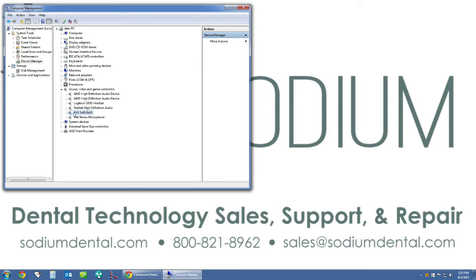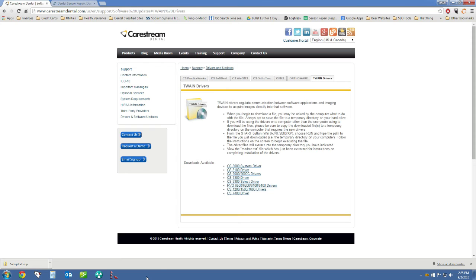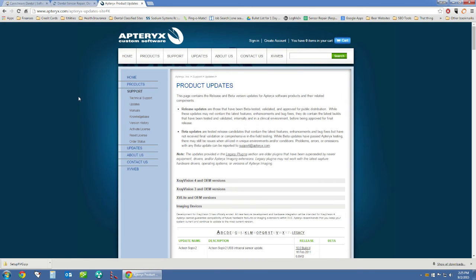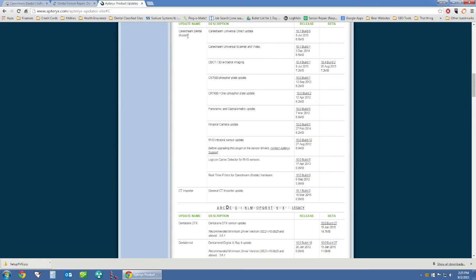This tells us that our sensor is installed correctly to Windows. At this point we need to integrate the Kodak sensor into X-Ray Vision. To do this, open a web browser and go to the Aptrix website. Once on the Aptrix website, click on updates. Scroll down and click C for CareStream, since Kodak is now under the CareStream name. That brings up a list of updaters for CareStream products. Look through the list and near the bottom you'll see the RVG intraoral sensor update — click on that link.